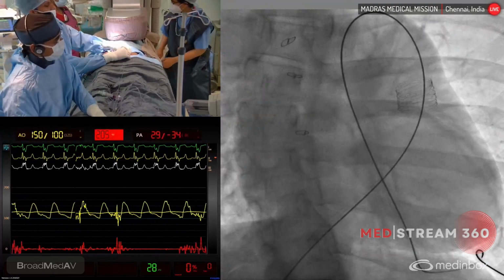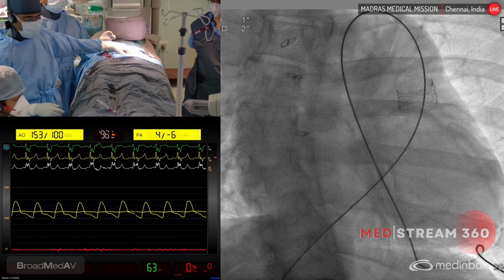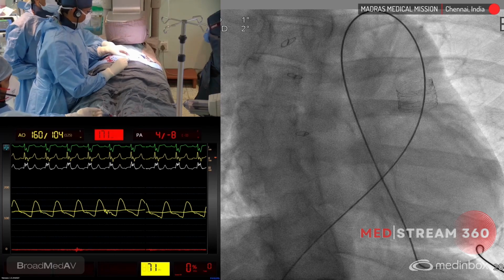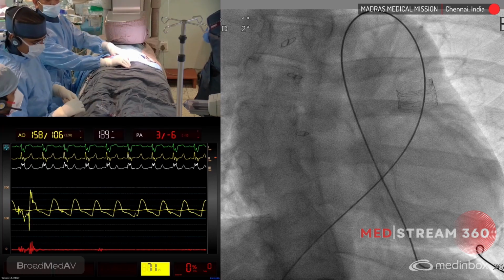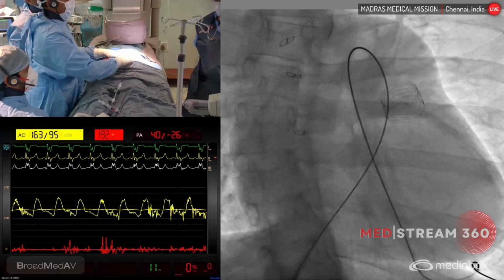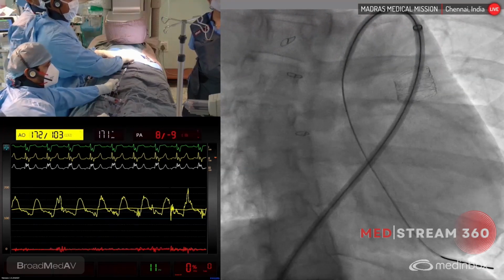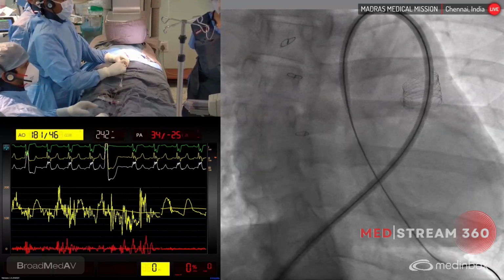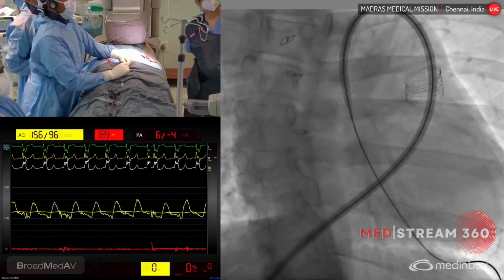the left pulmonary artery. Now we will try to get a short 14 French dilator to dilate the groin sheath. This step will make it a little easier for the 12 French sheath to pass through. So now we have a 12 French long braided Flexor sheath. As you are holding it, trying to advance. So the dilator has already passed.